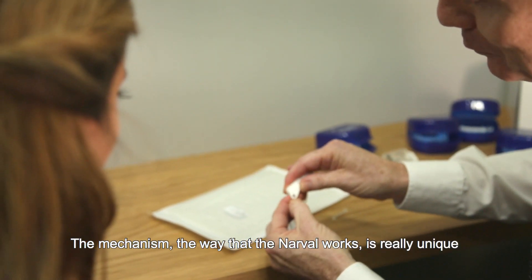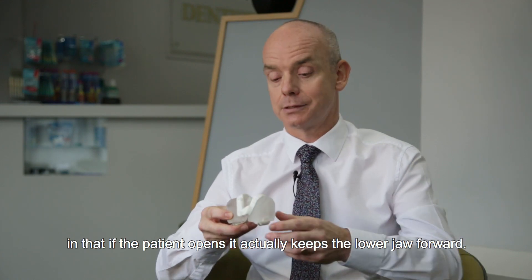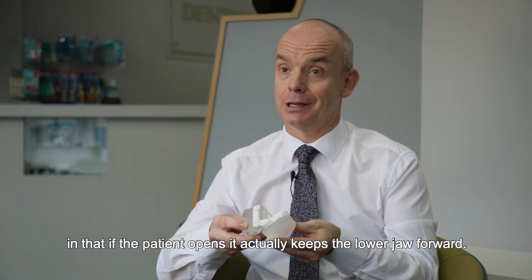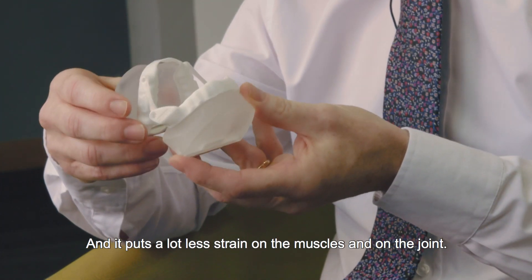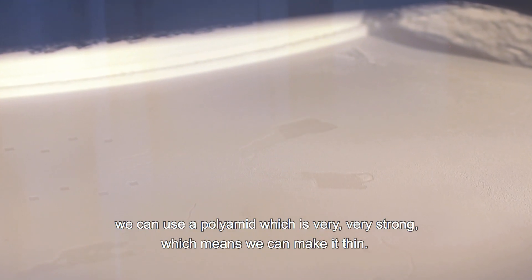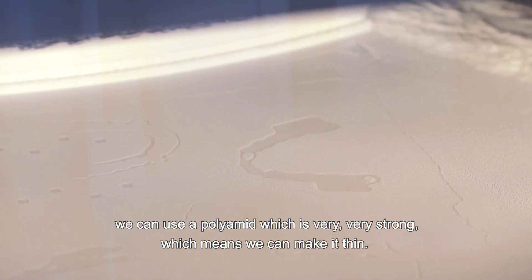The mechanism — the way that the Narval works — is really unique in that if the patient opens, it actually keeps the lower jaw forward and puts a lot less strain on the muscles and on the joint. The way that it's digitally made, we can use a polyamide which is very, very strong, which means we can make it thin.